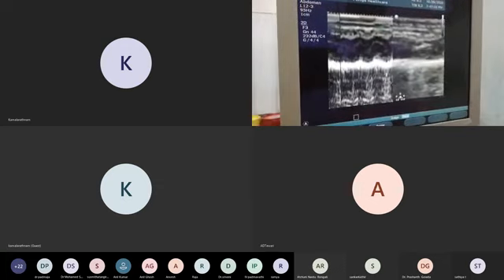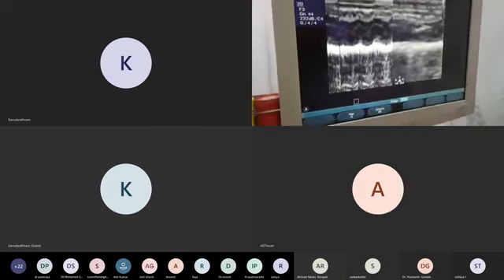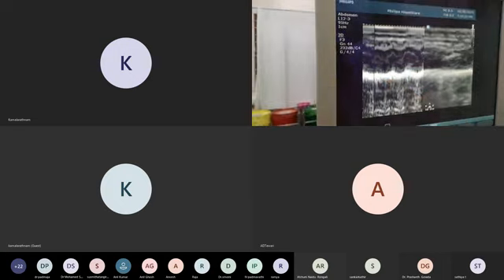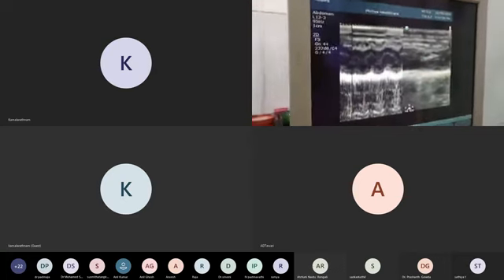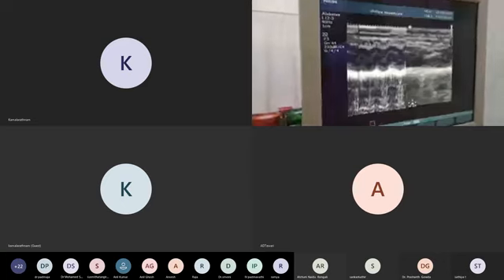Does barcode mean it always has to stay like that? It need not be. Always, do you think it should be like that? Need not be. See, whatever is on the top, it will appear like that only. Because see, it is all barcode-like. So you understood what you mean by barcode, what you mean by seashore. Okay, now only you understood.